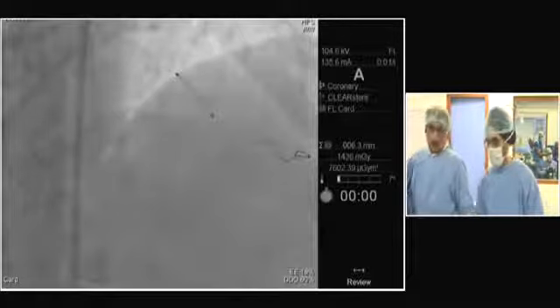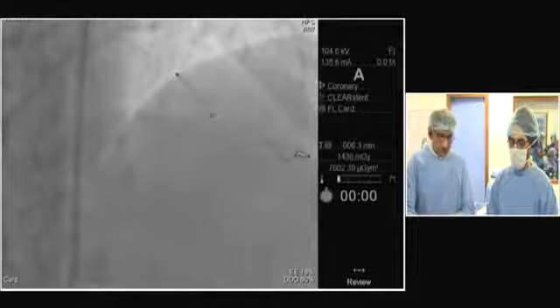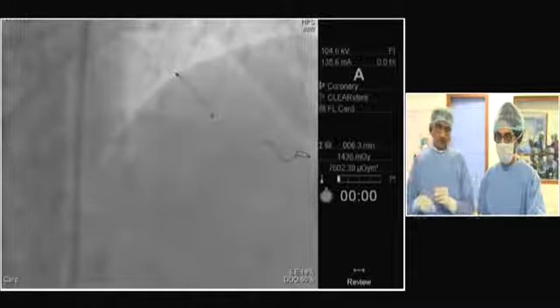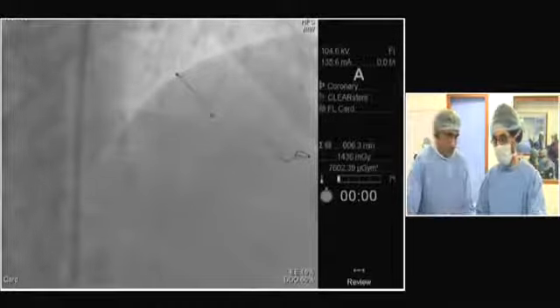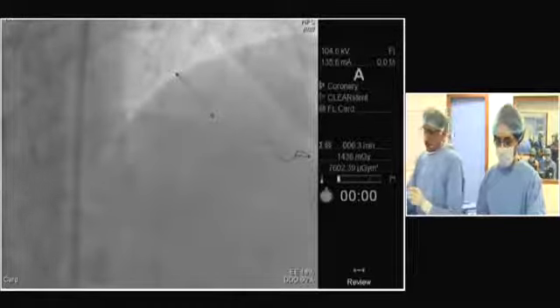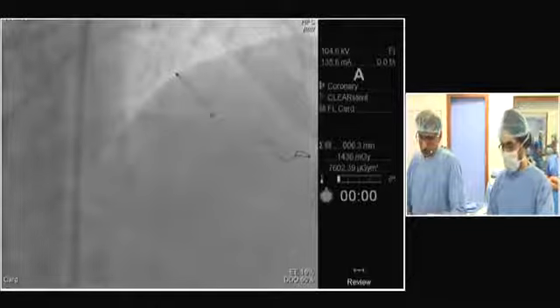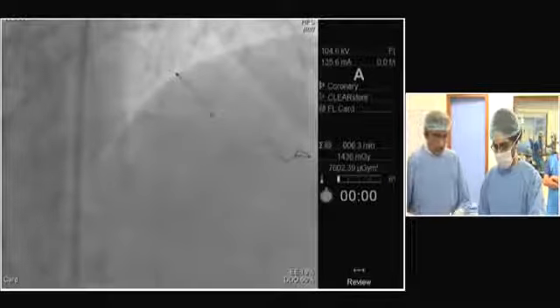Any comments? So the patient had an old inferior wall infarction about 8 years back. His posterior inferior territory is akinetic. LV ejection fraction is 45%. So our plan is just to do the LAD, diagonal and the circumflex. We'll follow him clinically, and if need be, the RCA can be opened. We know that it is totally occluded, but it can be opened. So we will handle that RCA later on. The discussion between bypass surgery and PCI was done with the patient, and he opted for PCI, despite being told that his MACE risk may be higher with PCI.